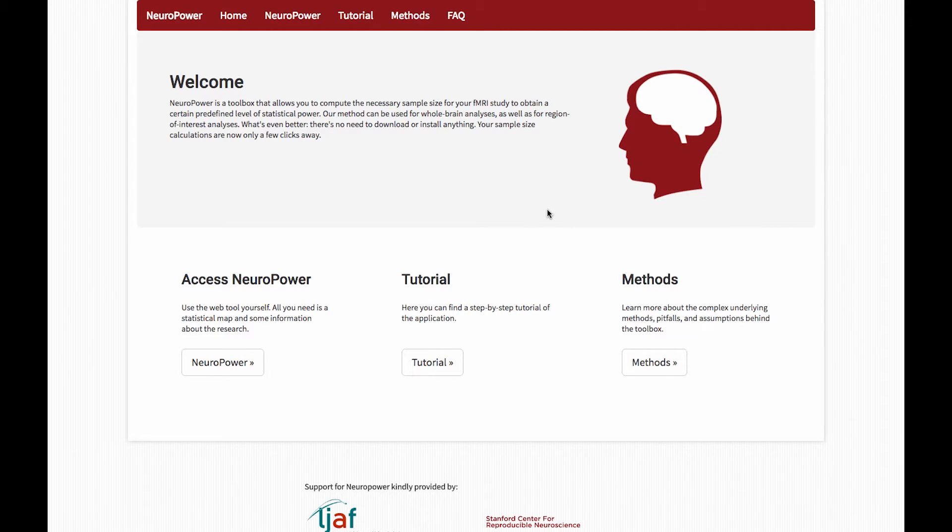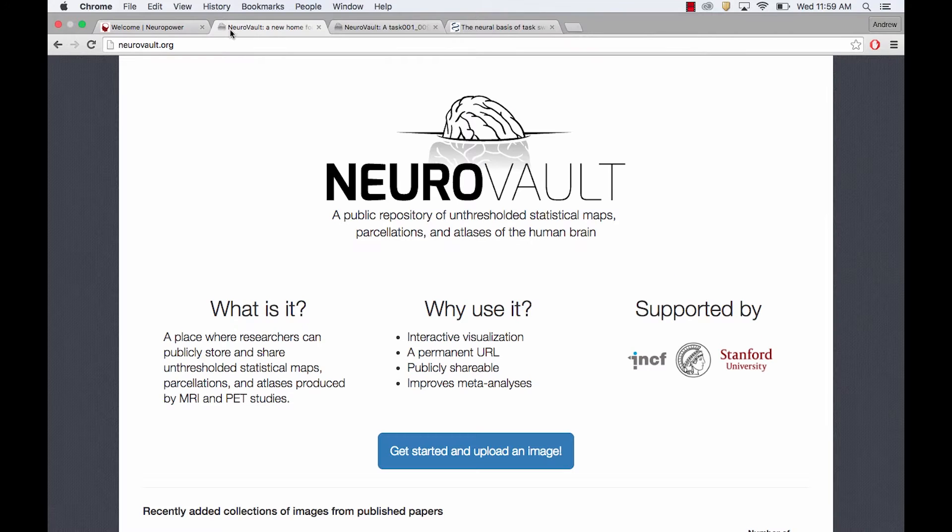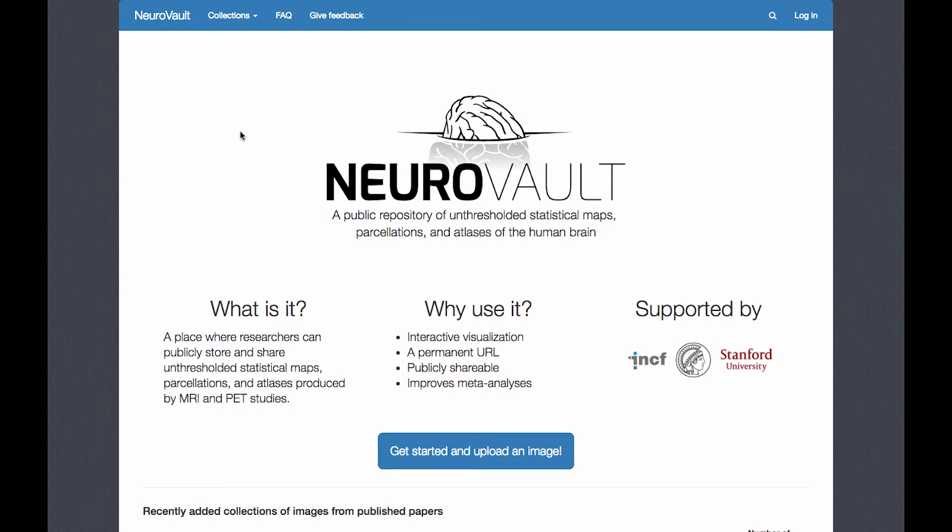To do our tutorial, we're going to be using a dataset from NeuroVault. NeuroVault has datasets and group-level maps from all kinds of studies. If you don't have pilot data of your own, you can use a similar study listed here to do power analysis.